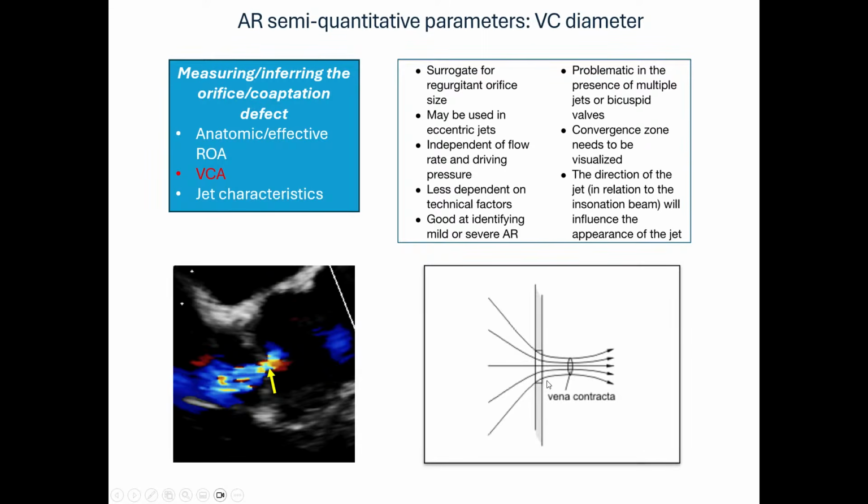The vena contracta is actually a concept from fluid hemodynamics. This is the area where the column of fluid is the narrowest, and it actually happens distal to the orifice. I learned this later on, but essentially, when you have columns of fluid going from a larger cylinder to a smaller cylinder through a hole, they continue to be constricted slightly more distally to the actual anatomical orifice, and the narrowest portion is just slightly distal to it.